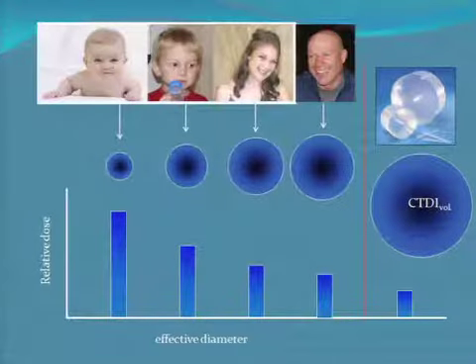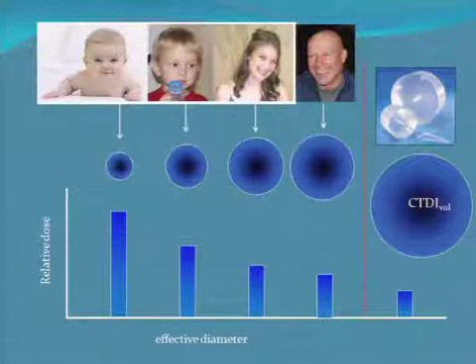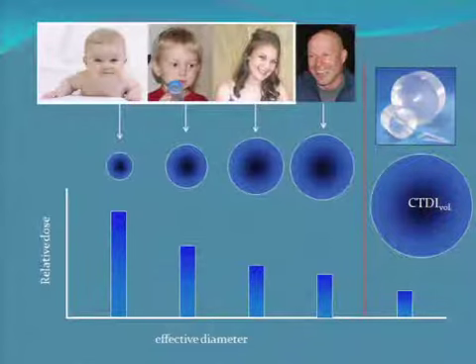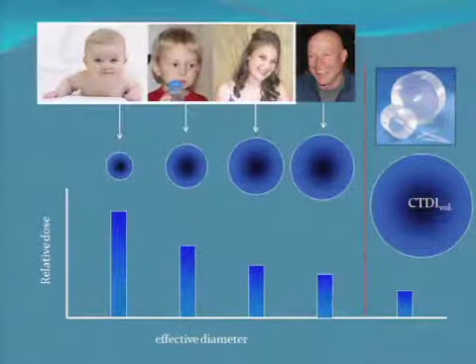This is, to me, one of the biggest challenges in the clinic once we started to look at these patient dose reports: to explain to the radiologists, this is not patient dose. Even though it says that, even though you imply that, this is dose to a phantom, a plastic thing that's only this big or this big, and that's it. There's two sizes. And that's really difficult for them to get a grip on, because our patients come in all sizes, from the tiniest tots to tiny older women and folks who really stretch the limits of our CT tables. And you know, there are patients who you wish you could sort of soap up so they slide through a little bit easier.